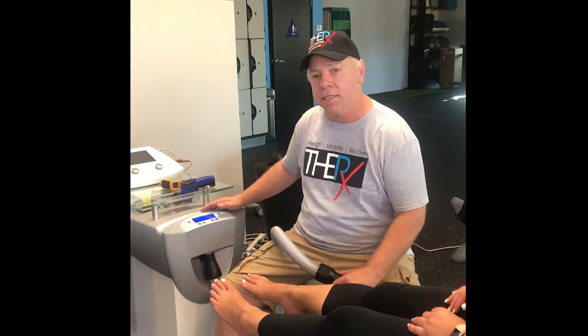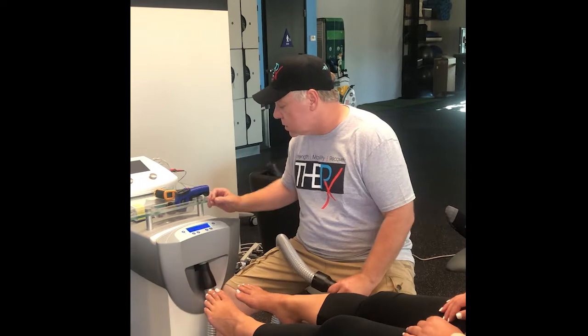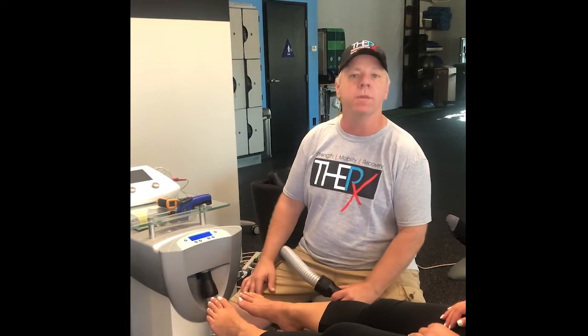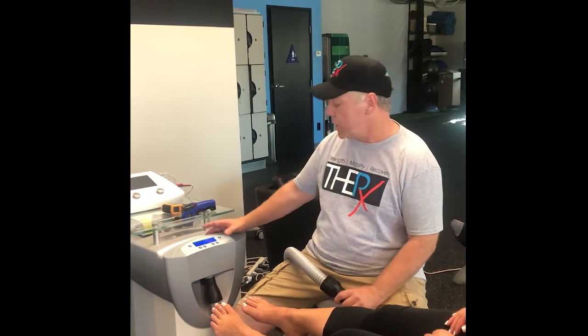The reason why I like this is you can hit spots that are very difficult to hit — say plantar fasciitis, like we're going to be doing today. The key difference is instead of having contact with the cold where you could potentially get a burn, and having an ice pack that's maybe only 32 or 34 degrees, this can get significantly colder and it can work in a shorter duration.